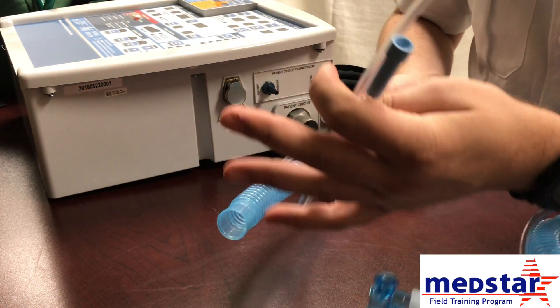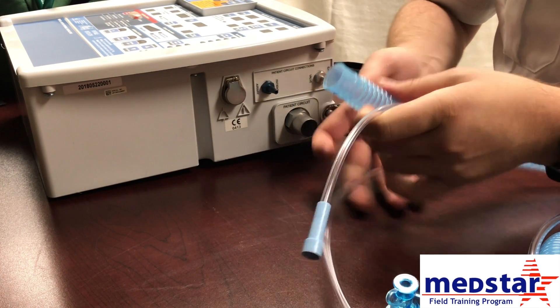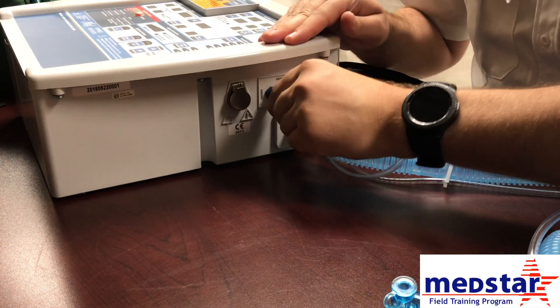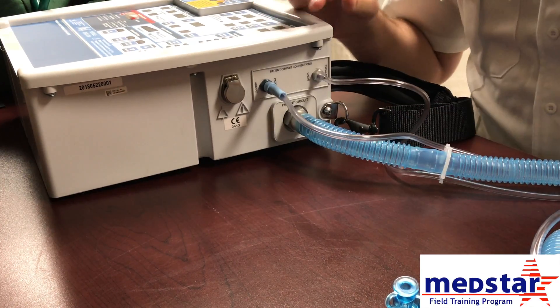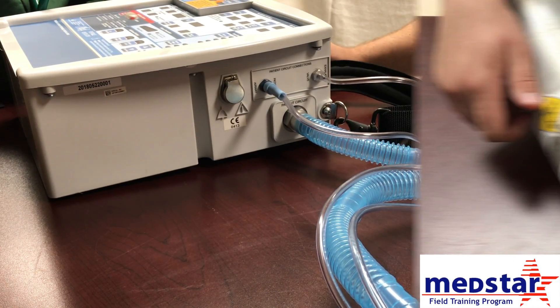Once you take it out of the bag, you have three connections that you have to make for the vent. Each one is indicated and they only fit on one spot, so there's nothing to worry about if you've picked the wrong spot. You just plug these in one at a time, nice and snug, to make sure all your connections to the ventilator are secured. Then your tubing is hooked up and ready to go.